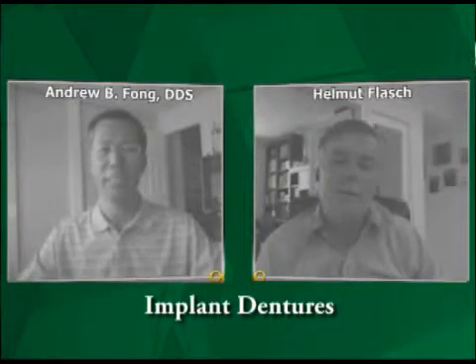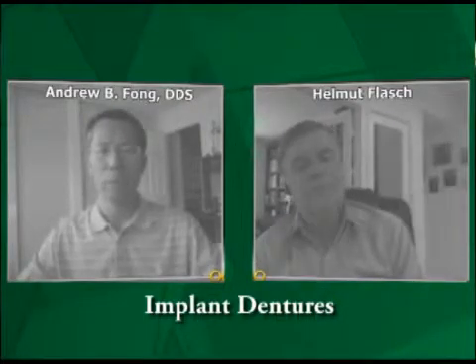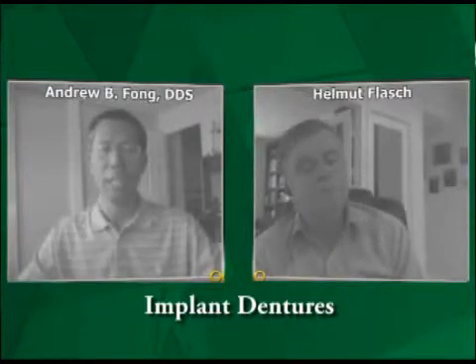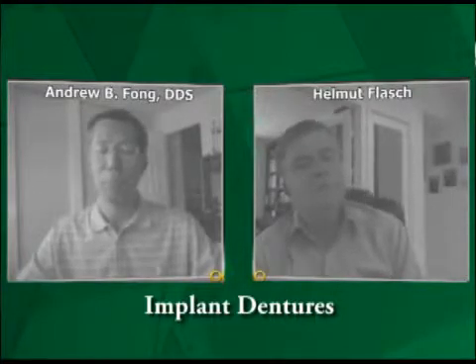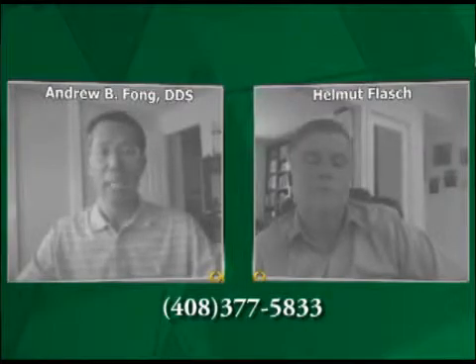Yes, absolutely. That option is available. The way that it works is that, depending on whether it's the upper or the lower jaw, a certain number of implants are placed into the jawbone. Those are used as posts for the denture to clip or snap onto, and that will help to replace all of the missing teeth on the upper or lower jaw. So even though it is a denture, that denture becomes a lot more stable because it is attached to those implant anchors, and that helps to prevent it from moving or clicking. So it's a stable denture that is attached to the lower or upper jaw.